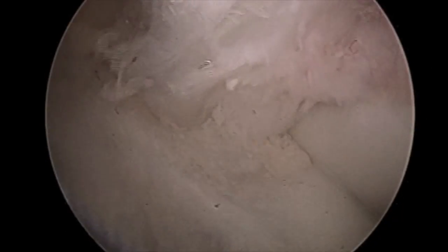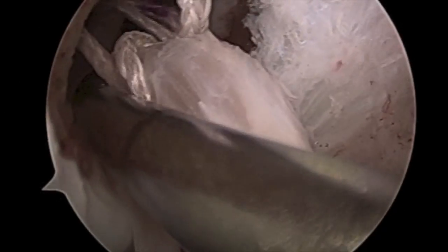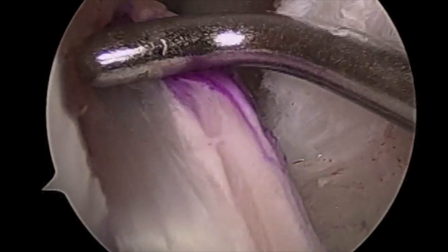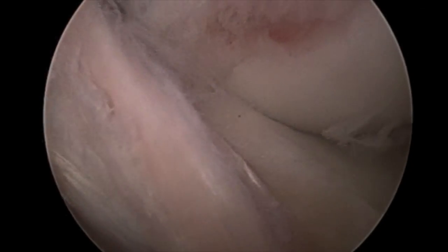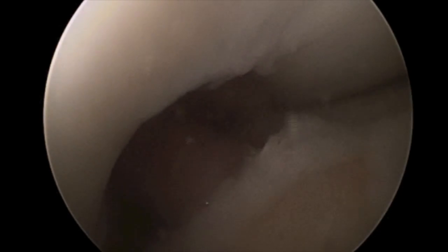The arthroscopic probe is used to deliver the shuttle suture out, which is utilized to deliver the quadrupled hamstring graft into the femoral tunnel with use of suspensory fixation. Final visualization of the ACL graft in flexion and in full extension demonstrates no impingement.